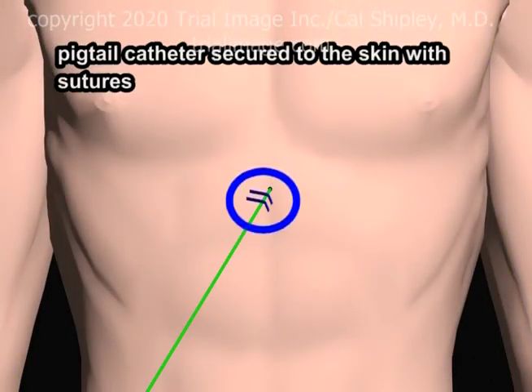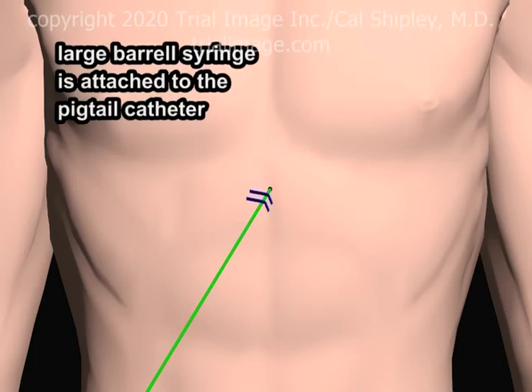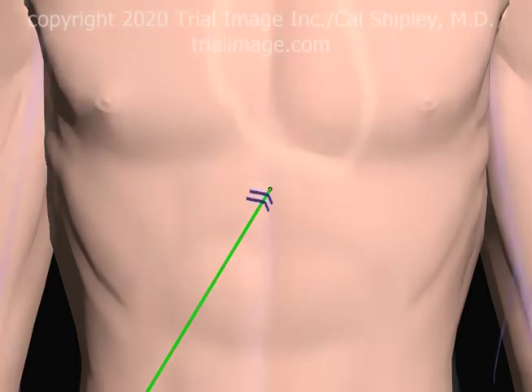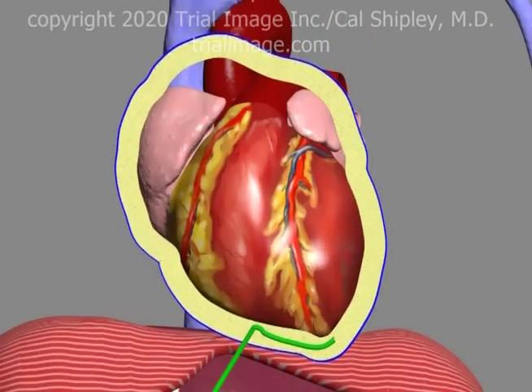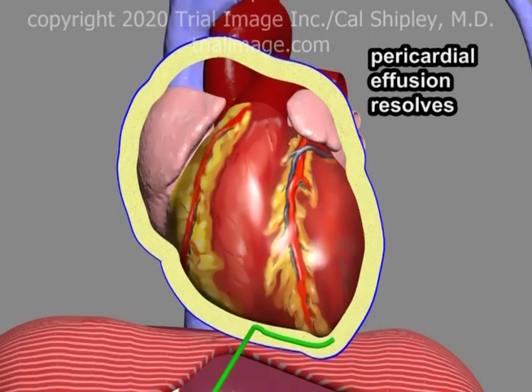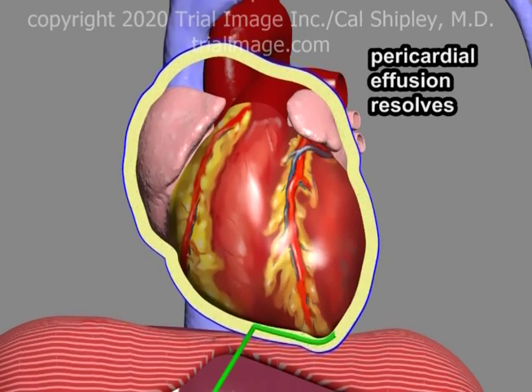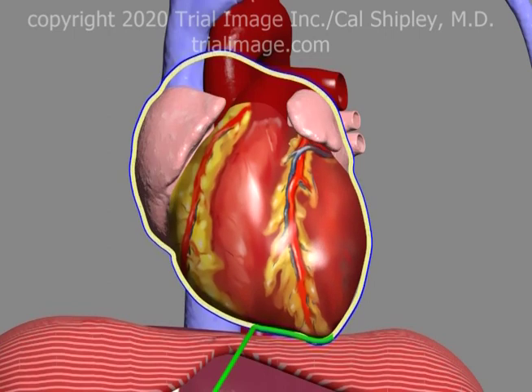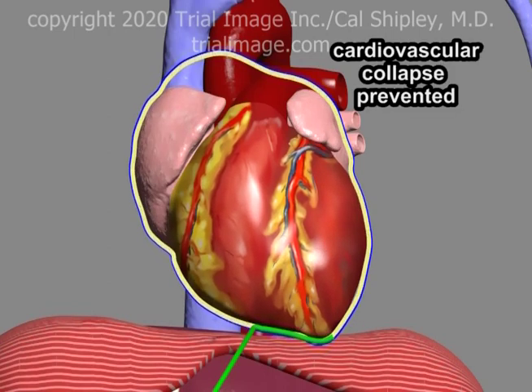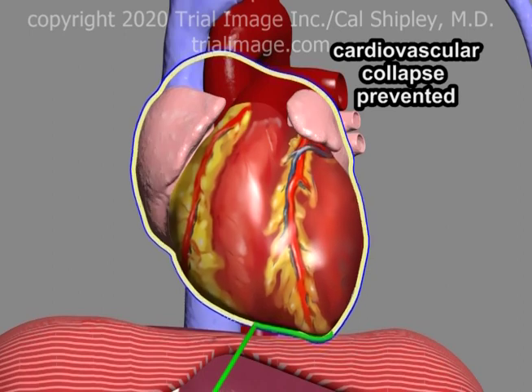The pigtail catheter is anchored to the external chest wall with sutures. Typically, a large barrel syringe is then attached to the pigtail catheter and the syringe used to actively remove pericardial effusion fluid until signs and symptoms of cardiopulmonary compromise have been relieved. The pericardial effusion is resolved, and cardiovascular collapse from acute cardiac tamponade is prevented.